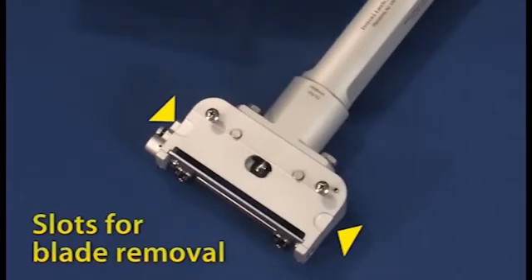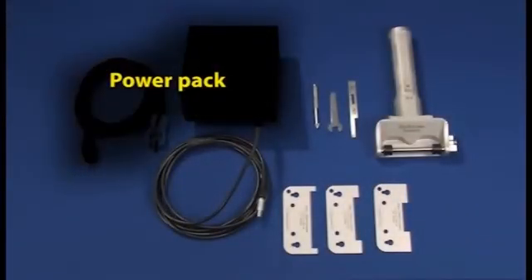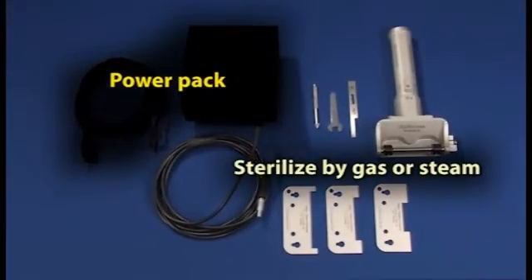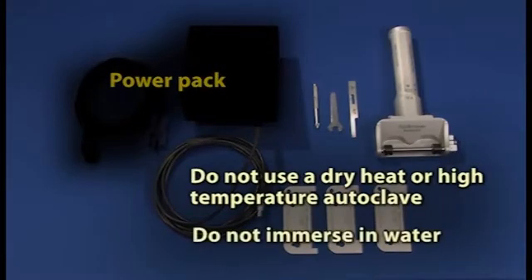The entire instrument, cord and plug can be autoclaved, but do not autoclave the power pack. The dermatome may be sterilized by gas or steam. Please refer to the owner's manual for sterilization specifications. Do not use a dry heat, high temperature autoclave. Do not immerse in water.